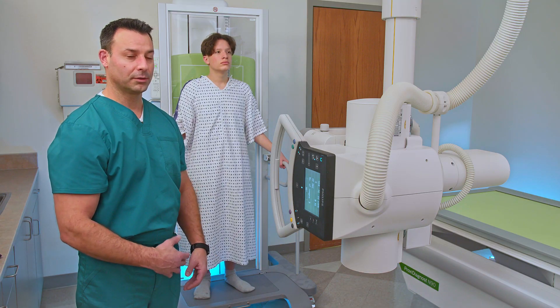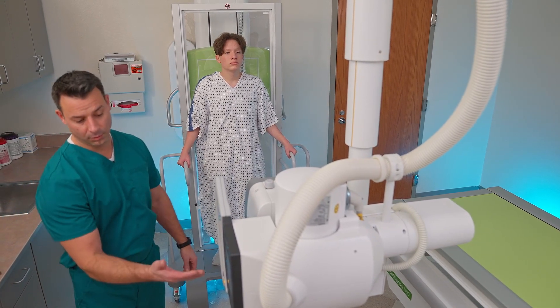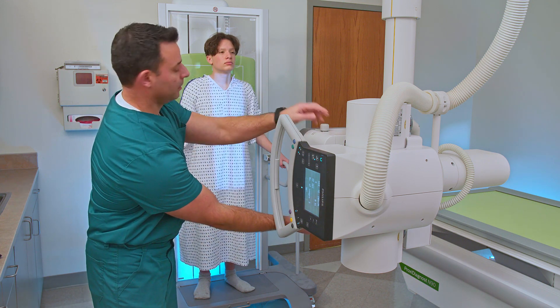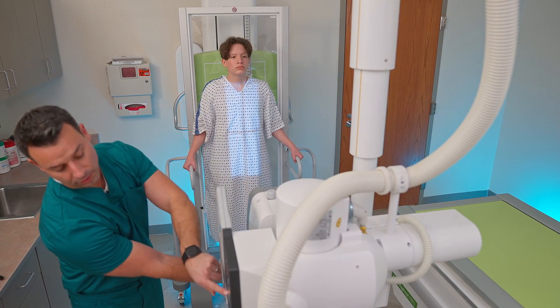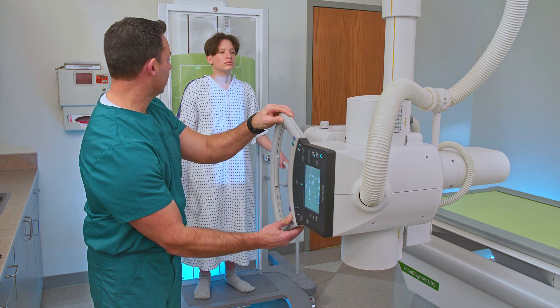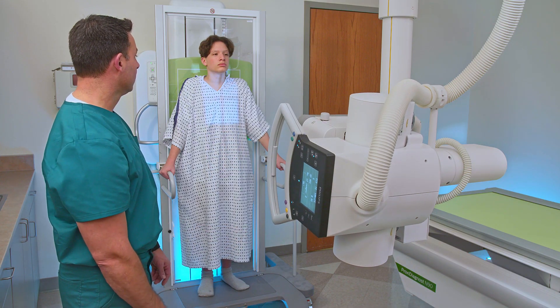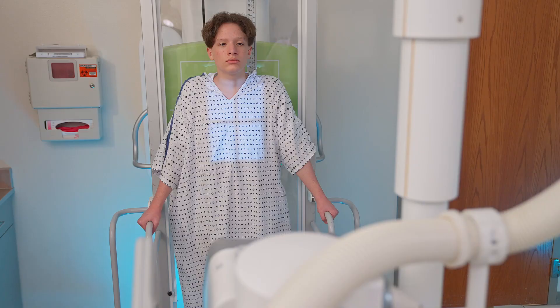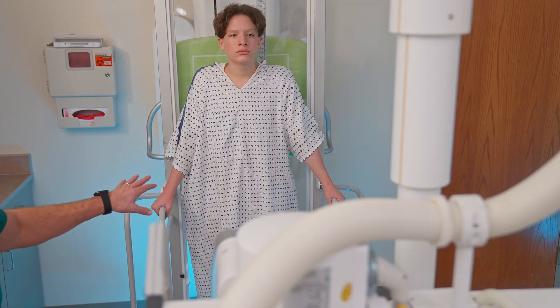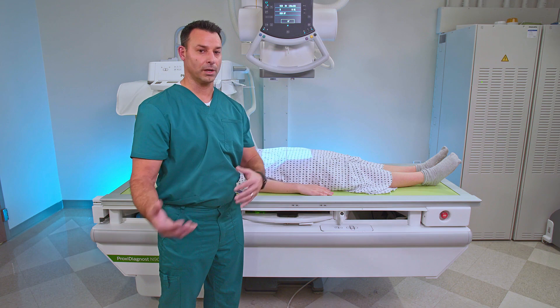With our Proxy Diagnost, the general x-ray portion also has the capability to do stitching. With our Aleva tube head and the stitching stand, it shows you how many images you can stitch. When you open your collimation up, it'll show three images; if you collimate down to the anatomy, it'll show two. You open it up to whatever anatomy you want to cover and move the tube head to position the collimator. We'll do a test sweep to show the coverage — exposure one, exposure two — and that covers the spine. The tube and detector then go back into position. That's the versatility of the Proxy Diagnost system: the capability to do general x-ray as well as fluoroscopy on this unit.